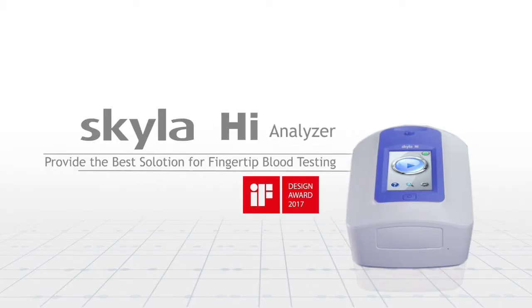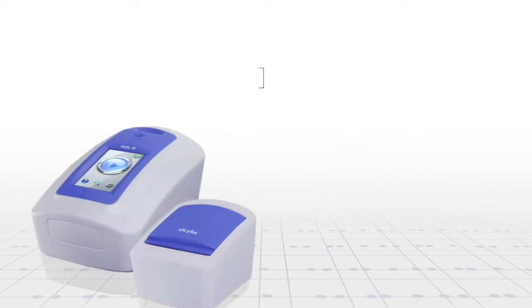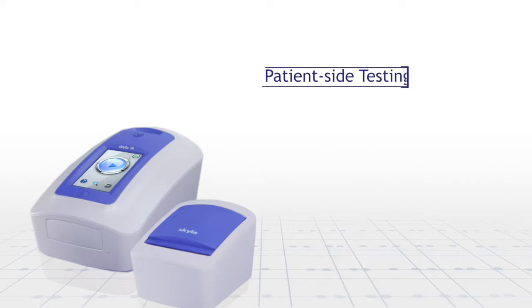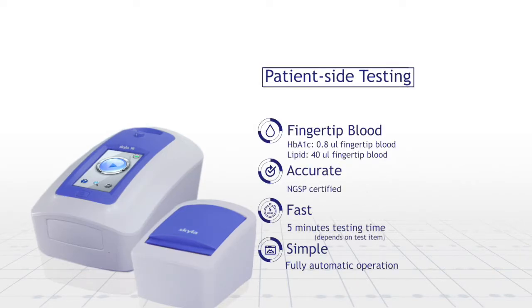Skyla HI Analyzer provides the best solution for fingertip blood testing in point-of-care application. The device includes patient-side testing features such as fingertip blood sample, accurate and fast test results.